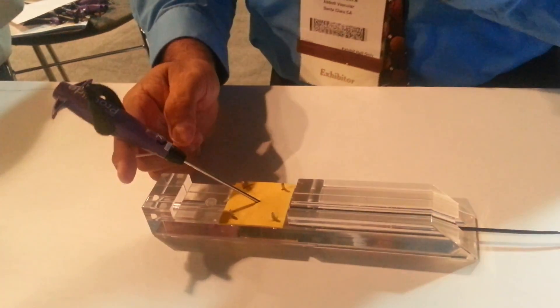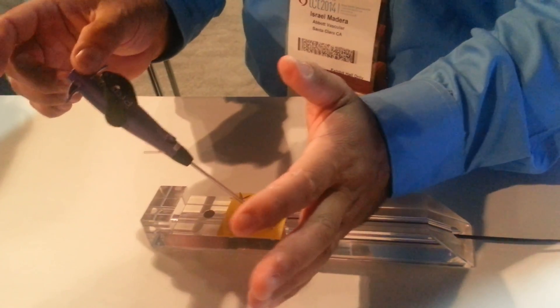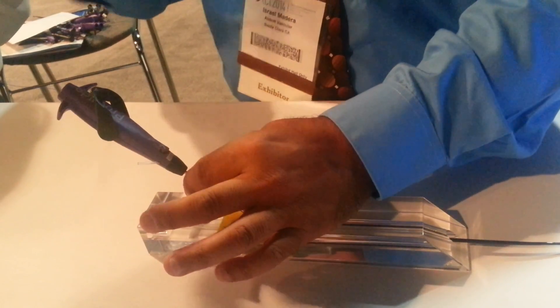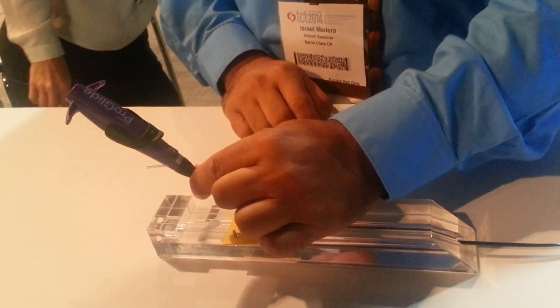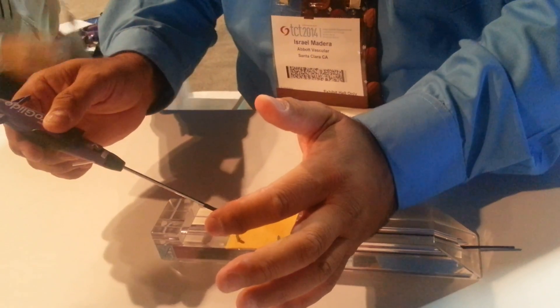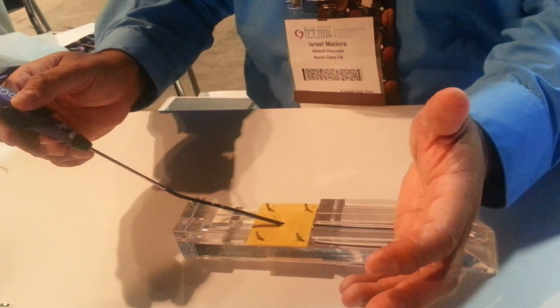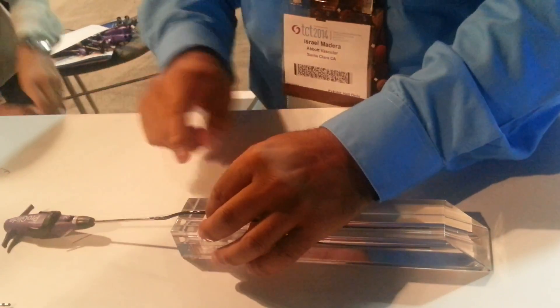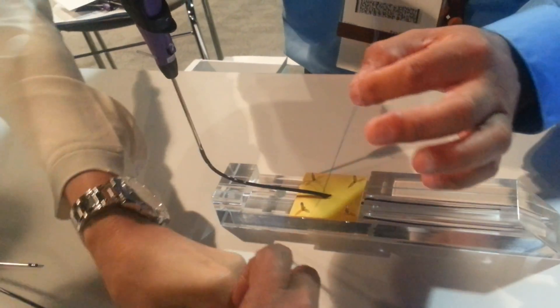So I'm still — as you guys can see — I still have pressure here and I'm still 45 degrees. Now I'm going to gently push the device down, because we had that tension against the arterial wall, and that releases the foot. I'll go ahead and close the foot, and then I'm going to go ahead now and remove. And you're going to get a little pop.